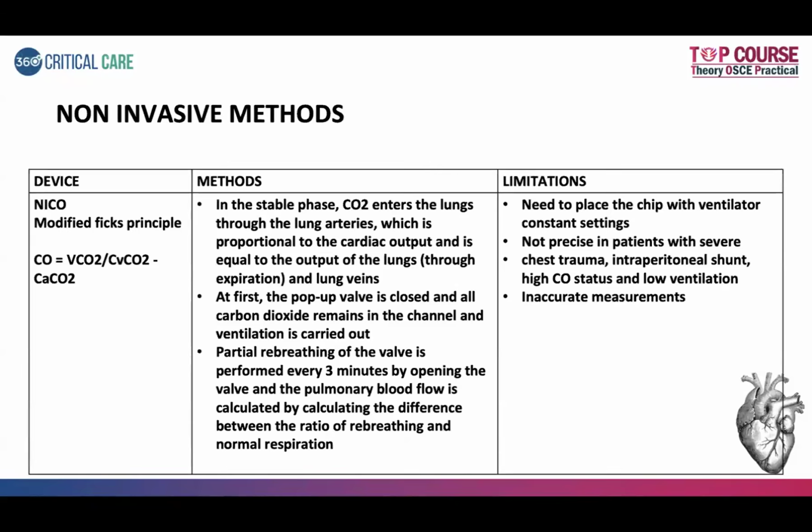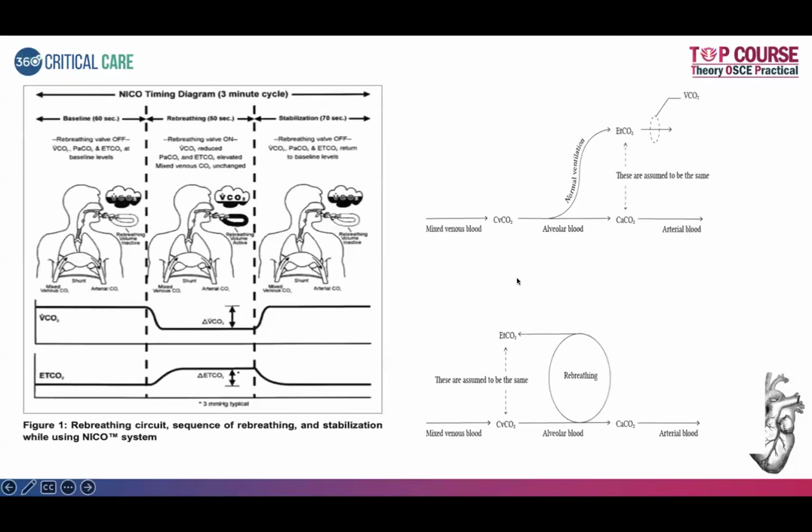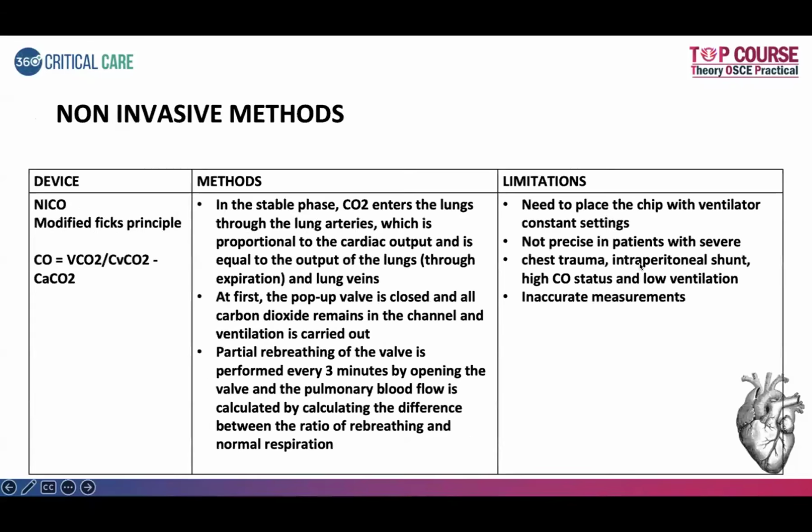Nothing but instead of oxygen, we are using carbon dioxide as an indicator for cardiac output by going less invasive, meaning non-invasive. So we know that normally, in a stable phase, the carbon dioxide enters the lungs through the lung arteries, which is proportional to the cardiac output and is equal to the output of the lungs.